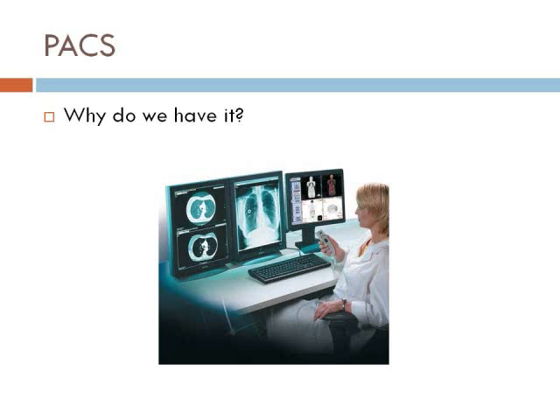And even for an X-ray that is taken, if they were to go to a lab and have the X-ray taken, the patient no longer has to have a copy of that film and then take it to their physician, or worry about how another physician or specialty physician is going to be able to have access to their X-ray results. We've had that problem in the past. Patients have to take their copies of their X-rays from one place to another physician as well, which can be a bit confusing. So it eliminates that. It's quick access.